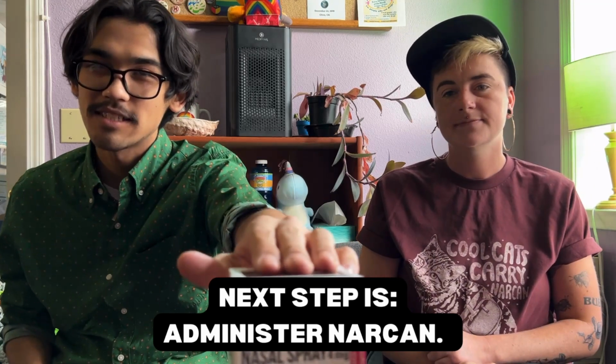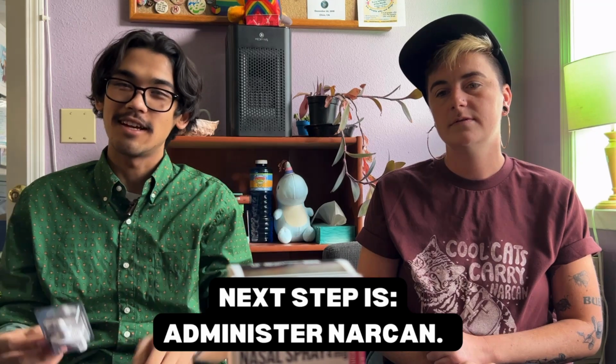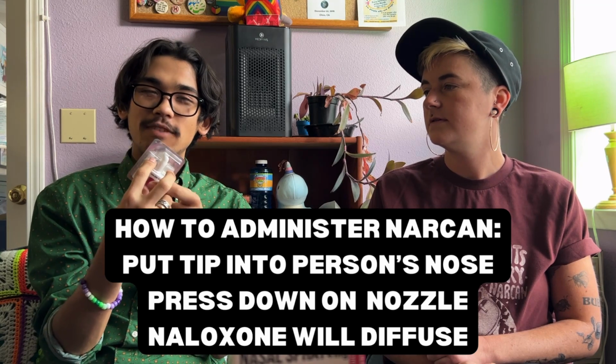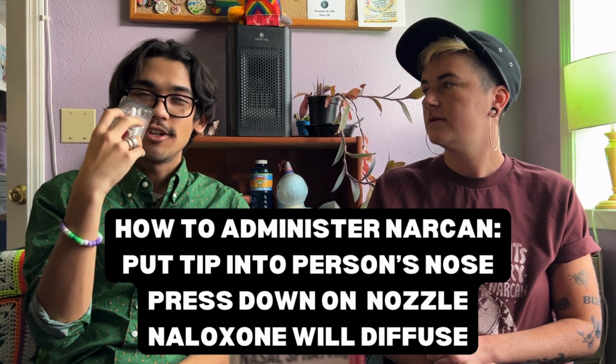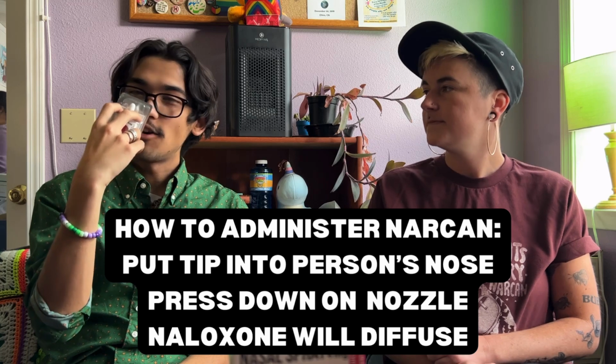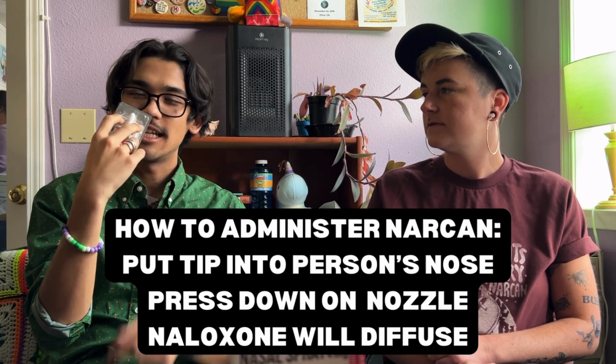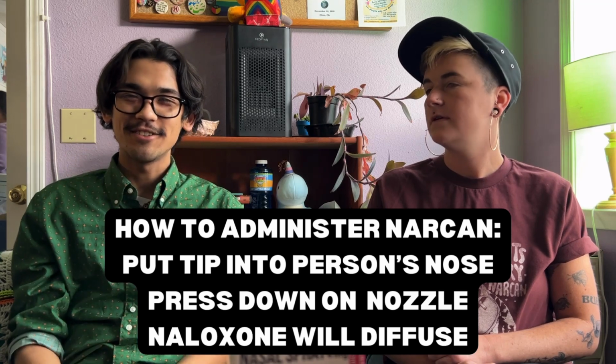Each of these boxes of Narcan has 2 doses of Narcan right here. It fits inside the palm of your hand. The white part goes into the nose and the red part goes on your finger. You're going to put it into the nose. It doesn't matter if it's all the way in, it just has to be into the nose. You're going to push down that plunger and it's going to administer the Narcan into the nose.